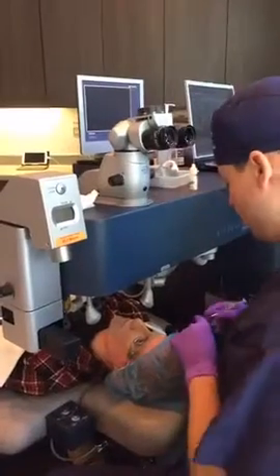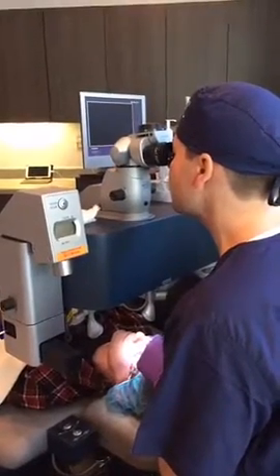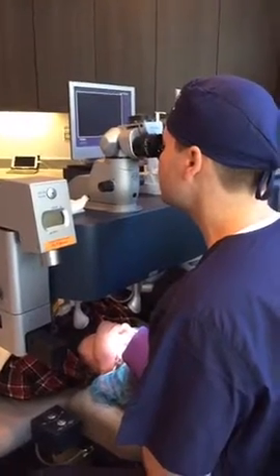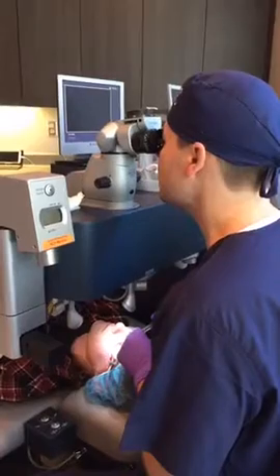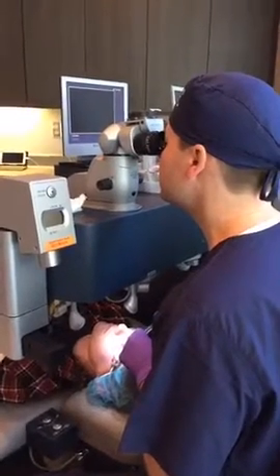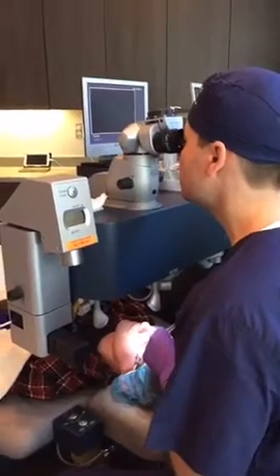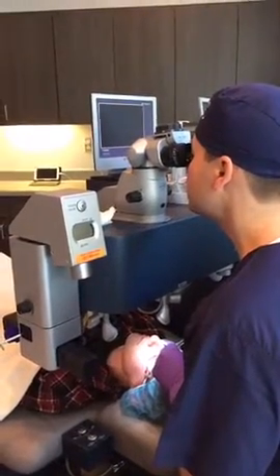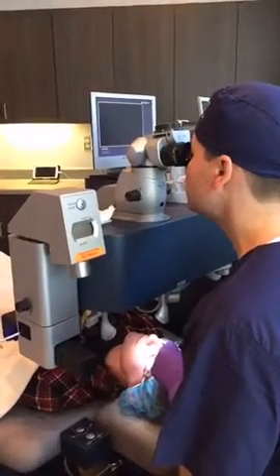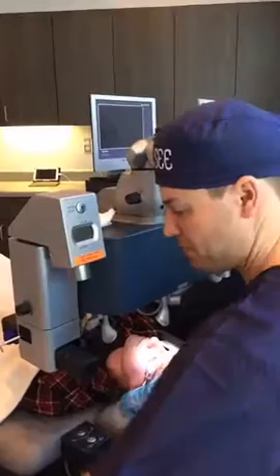We'll finish with the laser treatment, a little bit of light, please. Feel some water coming across your eye. Don't be startled by the water. And just continue to look straight ahead there toward that green blinking light. Watch the green light, please. Awesome.